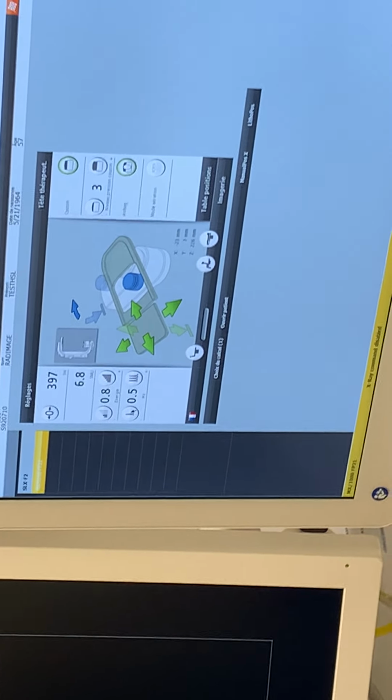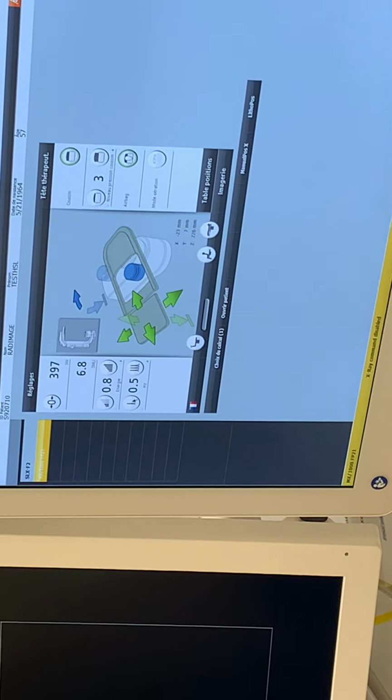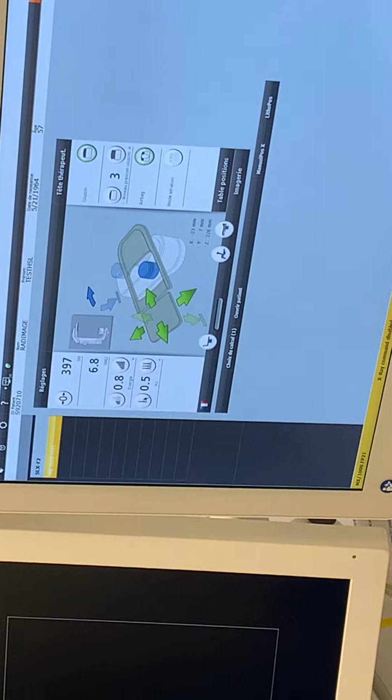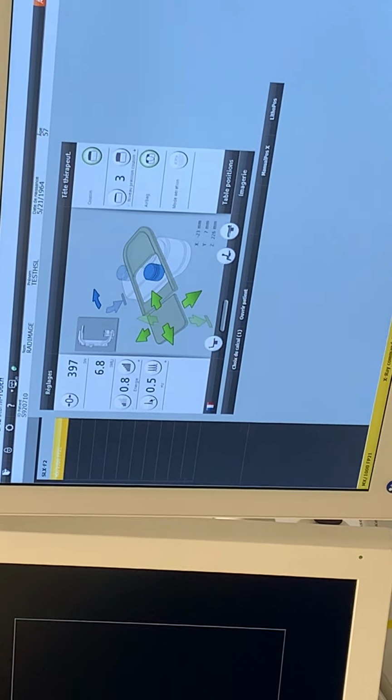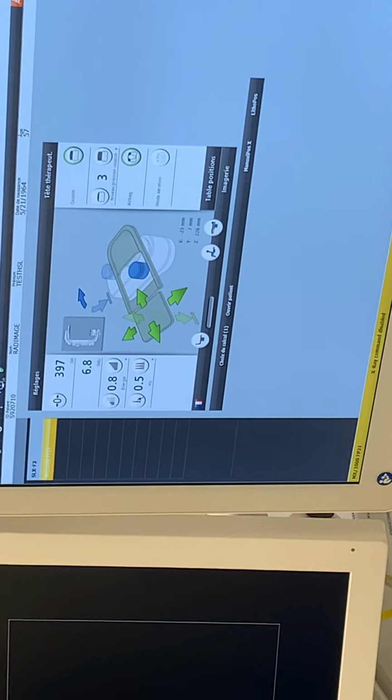Now the treatment is finished. For example, we are finished with the treatment. The stone is treated, the stone is crushed, or we reach the 3,000 shocks. However, the treatment is finished, and we're happy, and you're happy, of course. You saved a lot of pictures. Maybe I can save one. Let me see. No, because there is no picture. Doesn't matter.